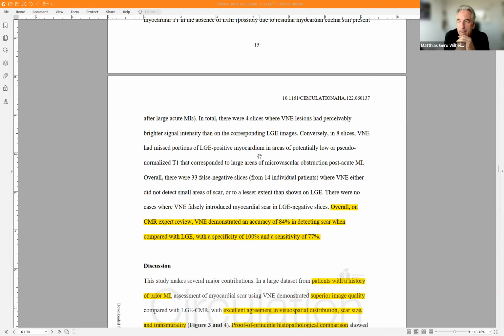To me that explains it: basically the goal of the algorithm is to get something more like the cine image, and not so much the LGE image, the cine image with the information of the mapping. So the cine images usually have a better quality, or are less sensitive to some of the artifacts than the late enhancement images. It's just a problem of co-registration that may in some cases be a problem.